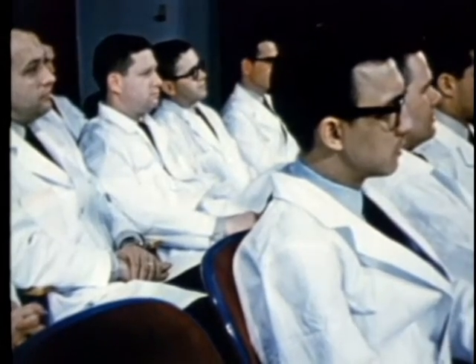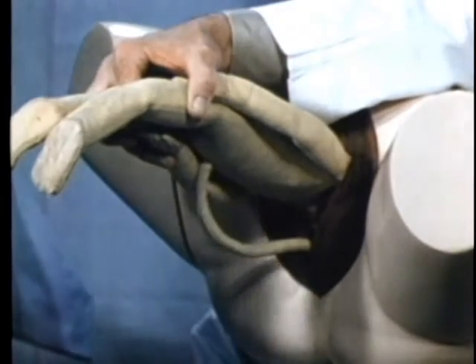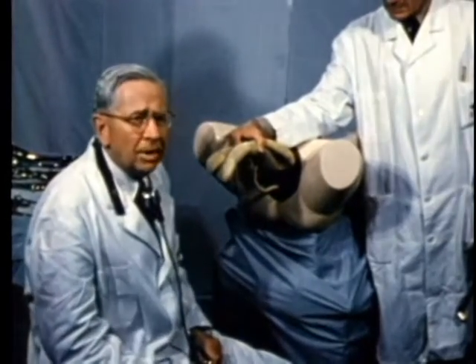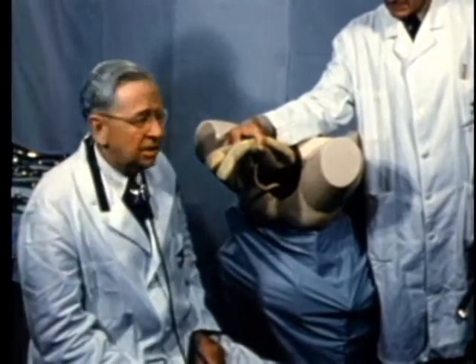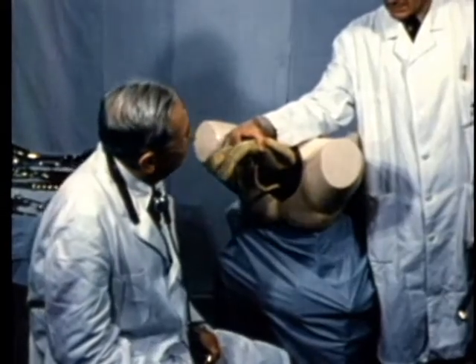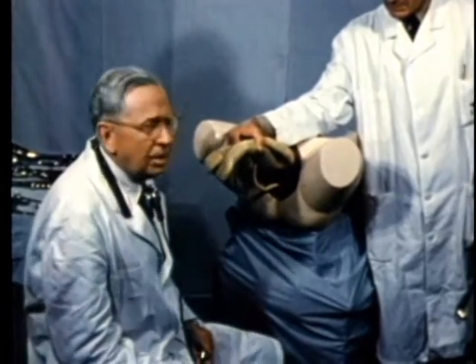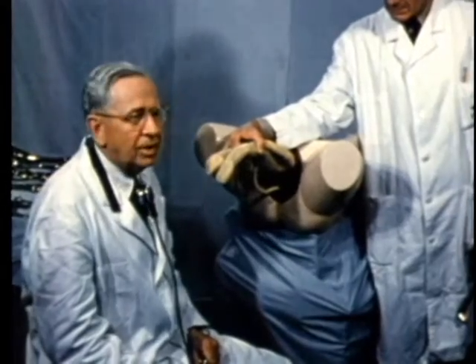Now for the technique. After the breech, the body, and the arms have been delivered, and the head has been brought into the pelvis by the Smellie-Veit-Mauriceau maneuvers, if there is any resistance to progress, the Piper forceps are applied to avoid the possibility of injury due to traction on the body or pressure on the aftercoming head.